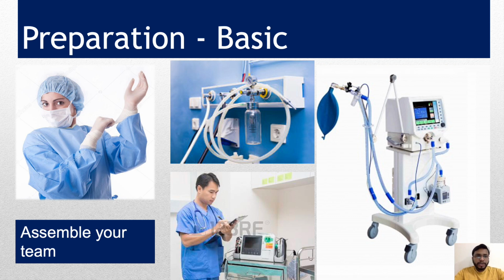Basic support team also has to be there. You have to have the airway supports. You should have the suction apparatus, including the ventilator settings and the monitors. Make sure that you have a comprehensive system where the entry and exit from the procedure is smooth.